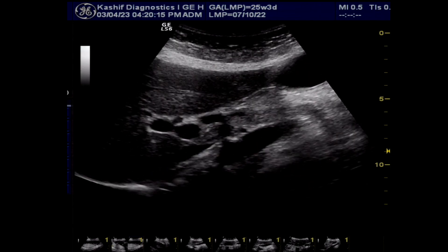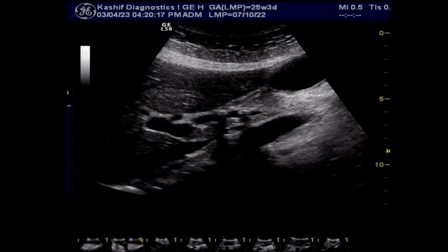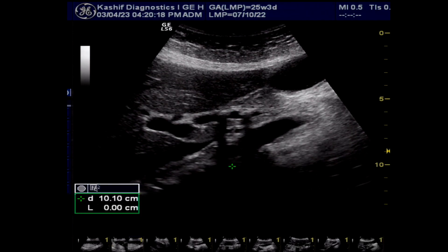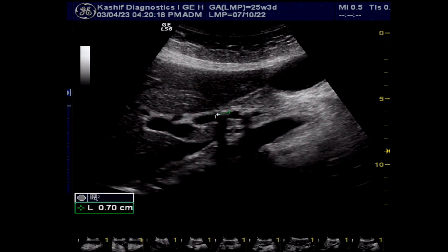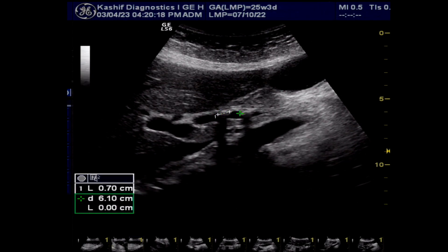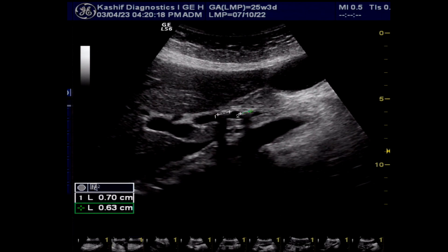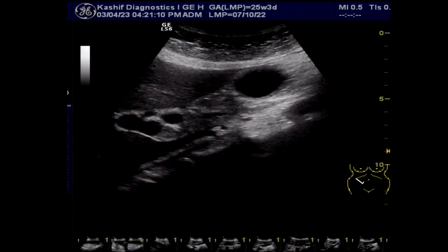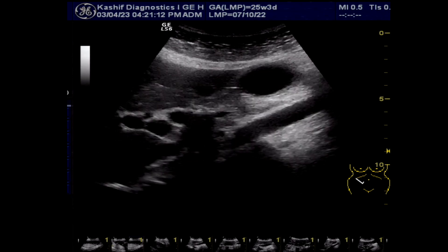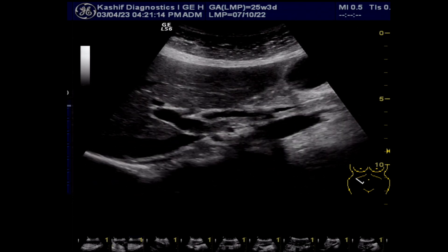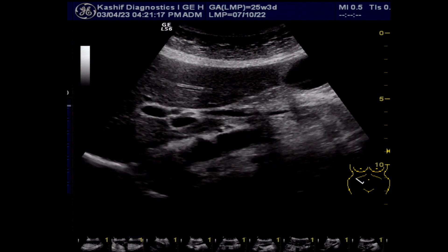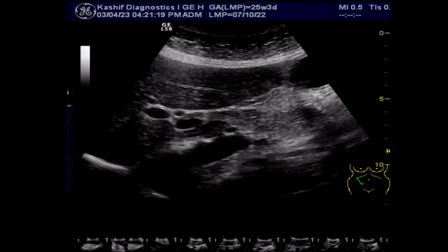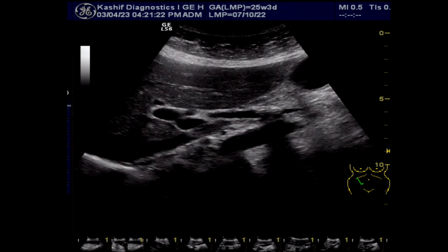In this patient, there is no need for deep breath holding, and the supine position gives a clearer view of the CBD compared to the lateral decubitus position. The scan is done during normal breathing. Multiple scanning techniques can be applied in different patients in order to get a clear view of the CBD, gallbladder, gallbladder neck, and cystic duct.